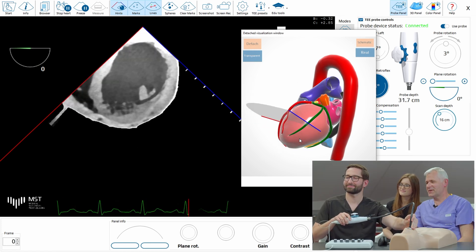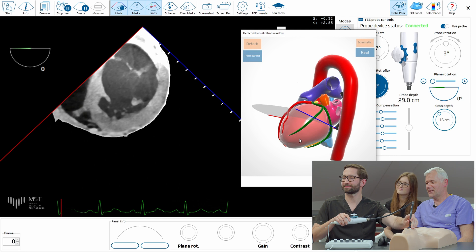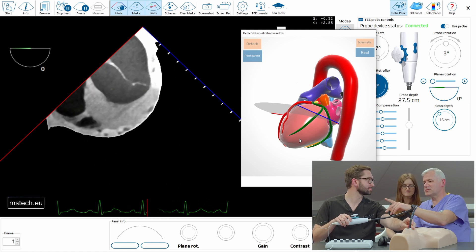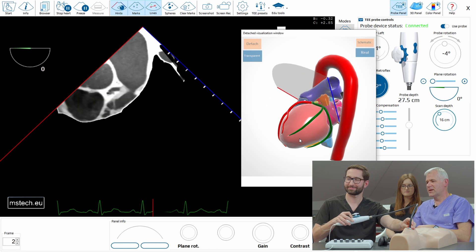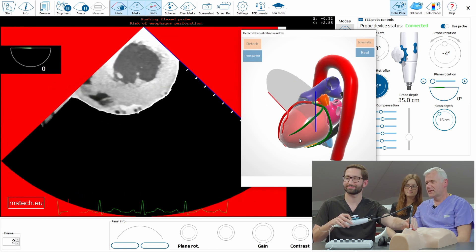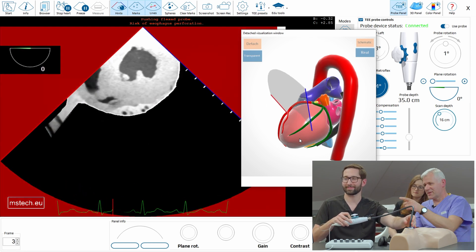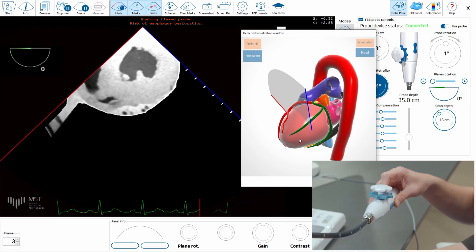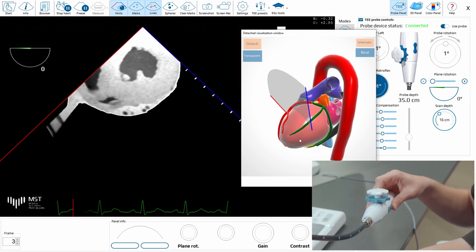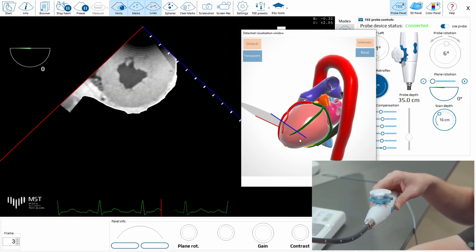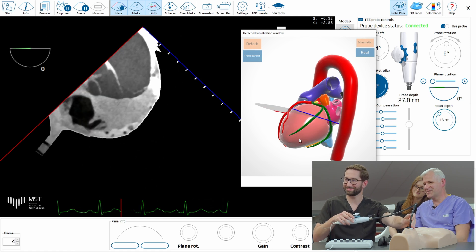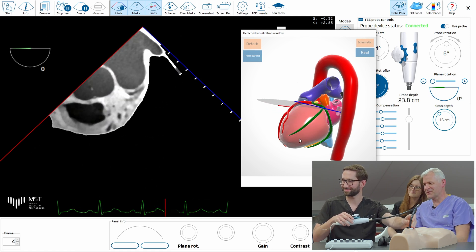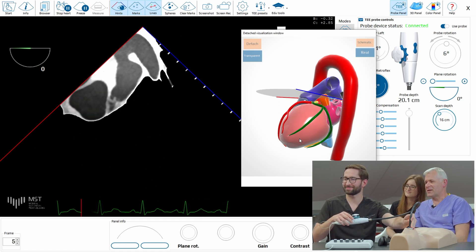No harm. And perhaps do something stupid, which is bend the probe onto flex and push the probe. So you see that this simulator tells you: you perforated esophagus, please avoid this kind of manipulation. It's just a simulator — fortunately the only simulator.